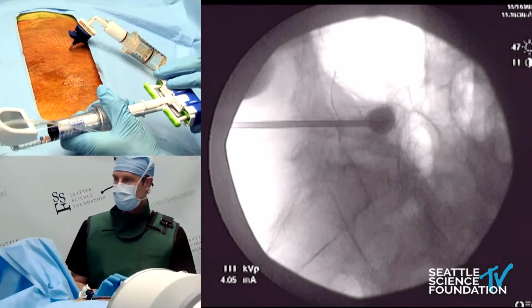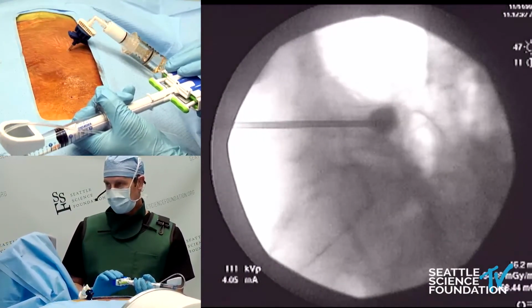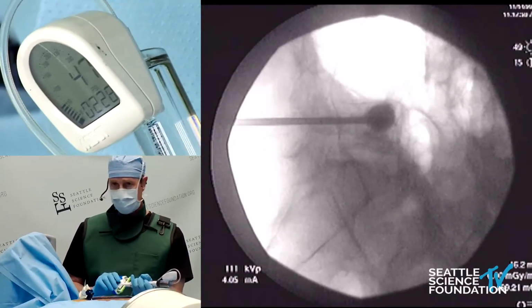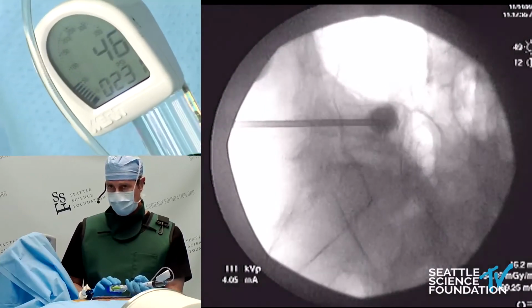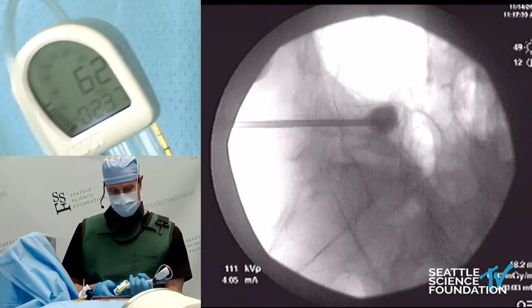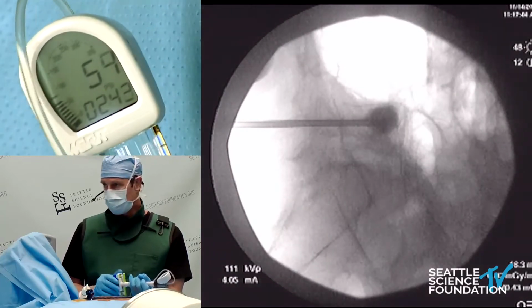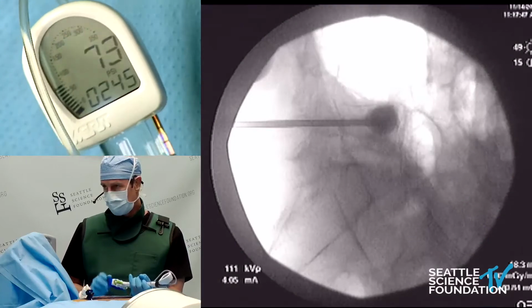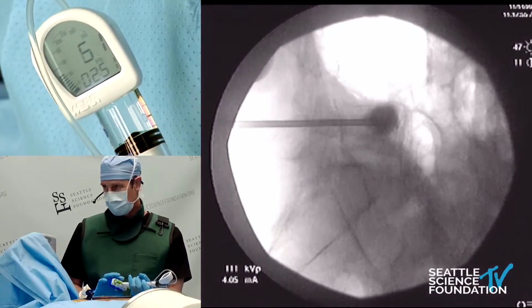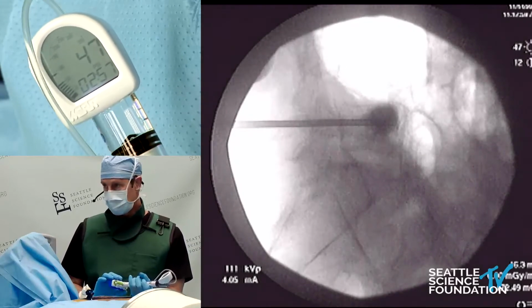The goal is to maximize the reduction, to fill it between the pedicles, and we want to try to get it as close to end plate as we can. Keeping in mind that this L5 is a big vertebral body. Again, the pressures are in the range of about 30 to 50 PSI, and only exceeds that whenever I really crank on it. So how beautiful is that? Fantastic. Really nice.